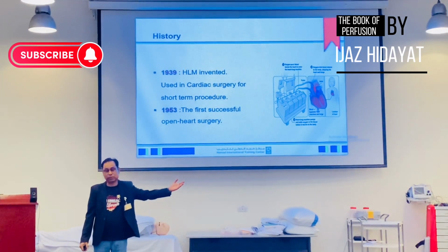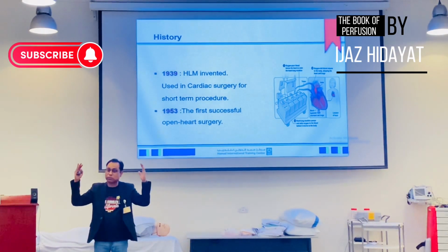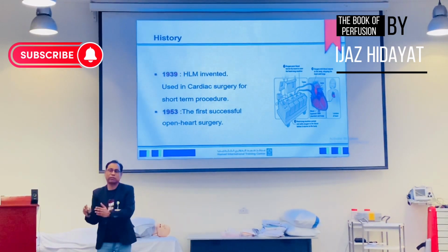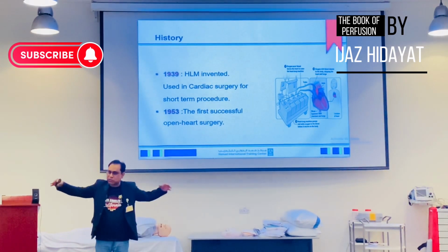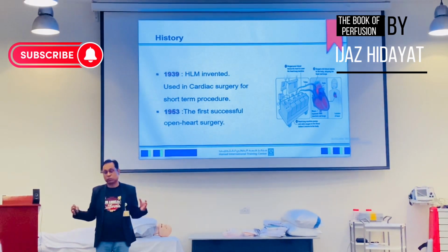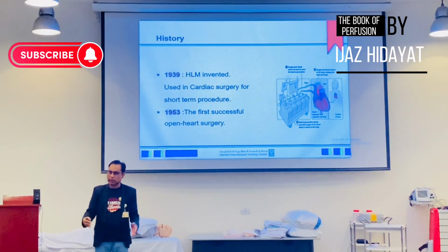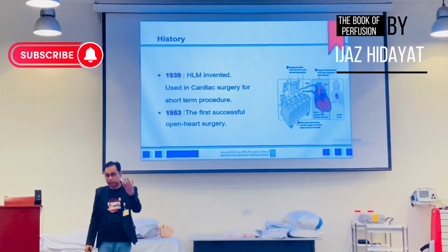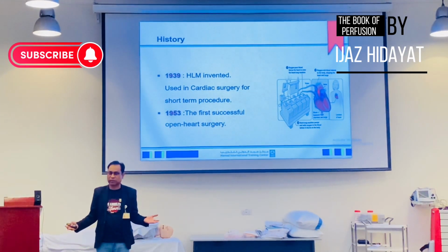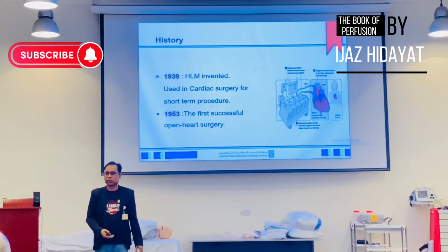So in case the patient was on ECLS, the first ECLS we need to discuss, it was in a specific place. We couldn't move the patient from one place to another because of the huge machines with big tubes, and there was a chance we could lose the patients. But now you can move even into a vehicle, in an aeroplane, and you can transport the patient and we have very good experience. The Hamad team have a very good team which does the transportation of the patients.